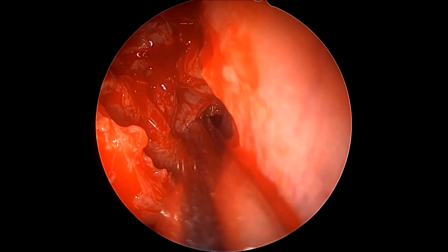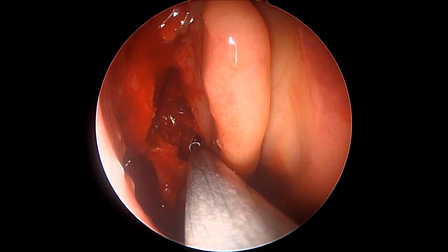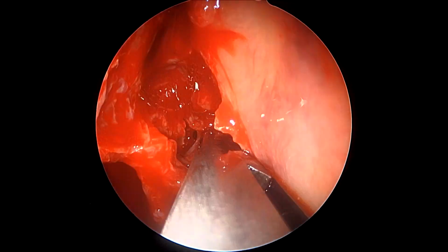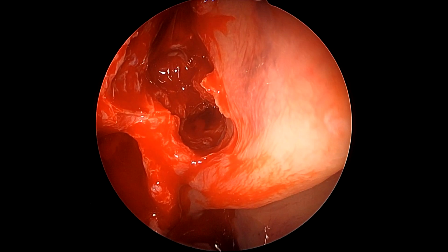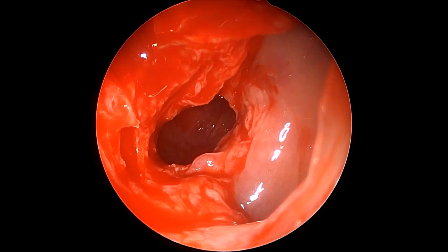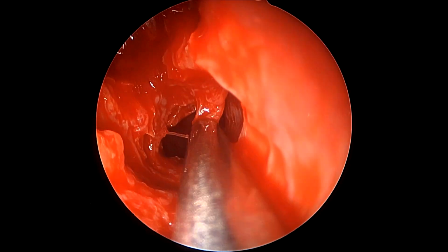As we enter the sphenoid sinus, sometimes the anterior wall is quite thin and can be widened by using a microdebrider blade. Otherwise, we advocate using a Hajek-Kofler punch, biting inferiorly and slightly laterally to enlarge the anterior face of the sphenoid. The goal of surgery, it has to be remembered, is to create a sphenoid ostial opening not too big but not too small, because this has to be irrigated and some bit of it will obviously stenose post-surgery due to scar tissue.